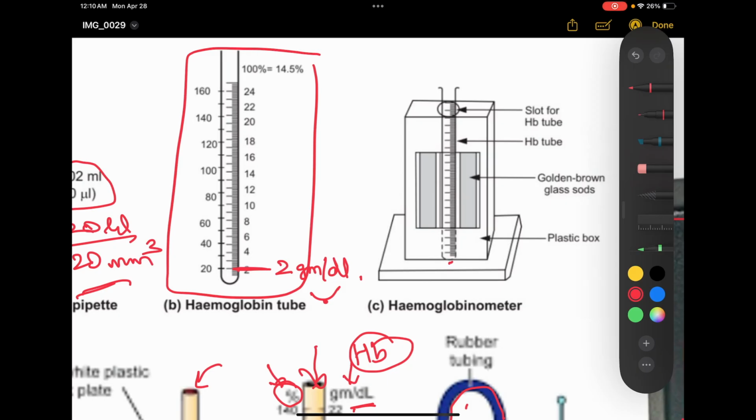Then you have to make a sterile finger prick. So, take the gauze piece, put spirit over it, then choose the finger. These three fingers are used for pricking. Then you will take the spirit and apply it from center to periphery.